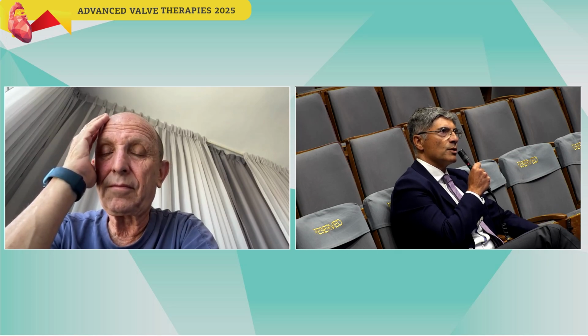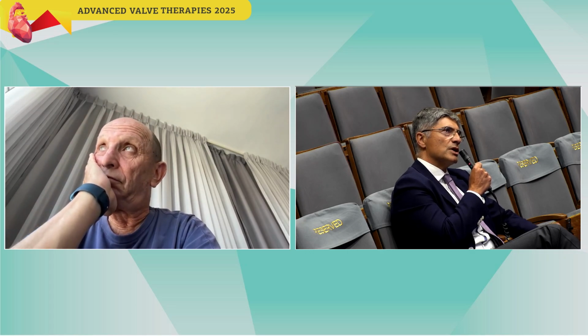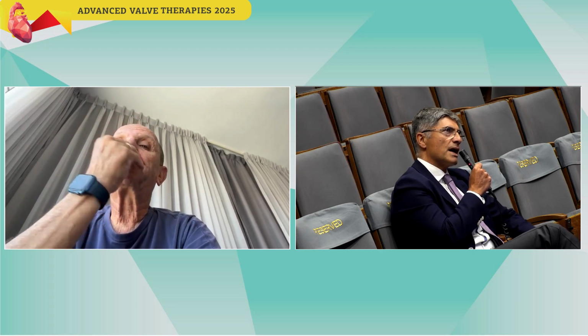I have to agree, you can use a balloon expandable valve as well, but in this situation we were expecting a high implantation of the valve to avoid any pacemaker implantation, but we didn't, and then to do a post-dilatation as well. But you can go either way.